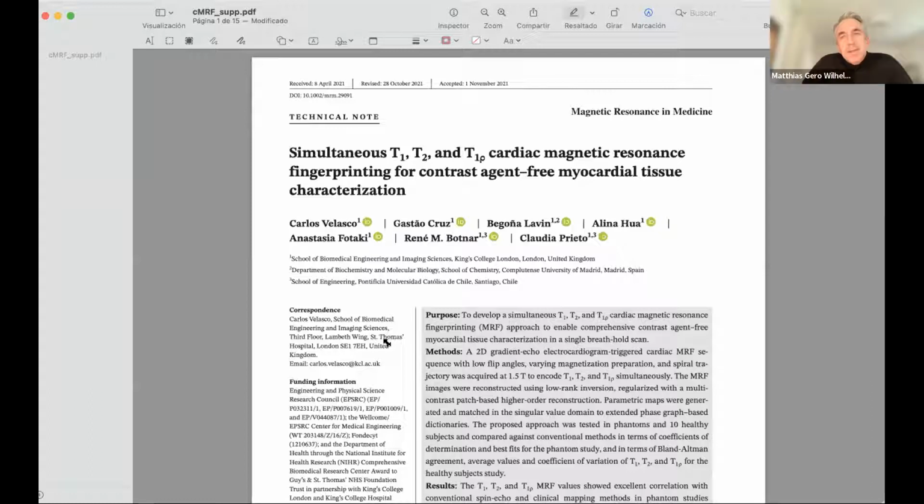And then the limits of agreement, specifically for T1, of plus or minus 50 milliseconds: do you think this will be ironed out somewhere, or will it be enough for clinical practice? I mean, 50 milliseconds is not necessarily huge, but it can make a clinical yay or nay.